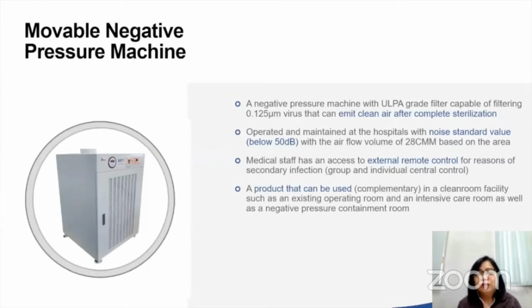The currently available movable negative pressure machine actually has ULPA grade filters capable of filtering up to 0.125 micrometers. So this is very small, much smaller. And these are very low noise, so they will not interfere with the hospital environment. The nice thing about this is that they also have UV lamps and external remote control. So you don't get scared that you have to turn it on, enter the COVID room. You can actually turn it on remotely. So this can be used in a clean room facility, such as any existing ORs or ICUs.